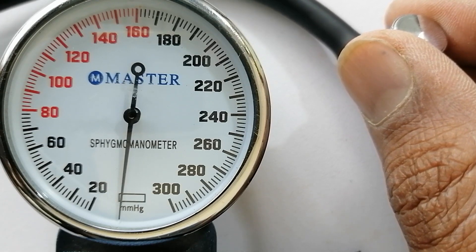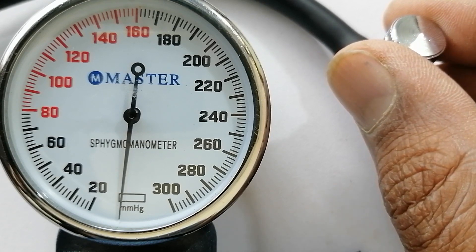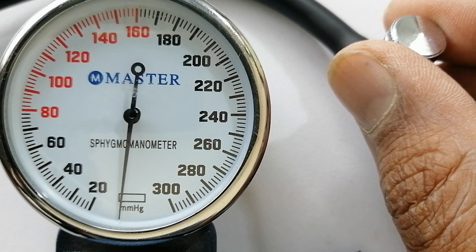This will be my diastolic blood pressure. You need to note the point where the sphygmomanometer needle was when you last heard the sound. This will be my diastolic blood pressure.